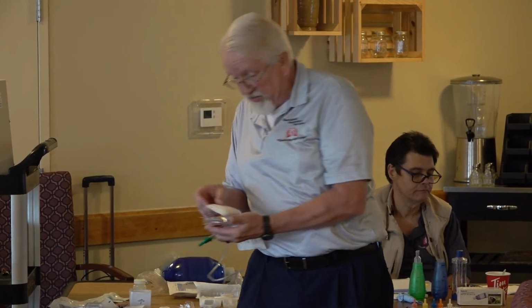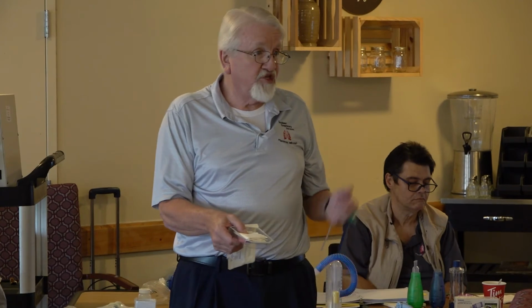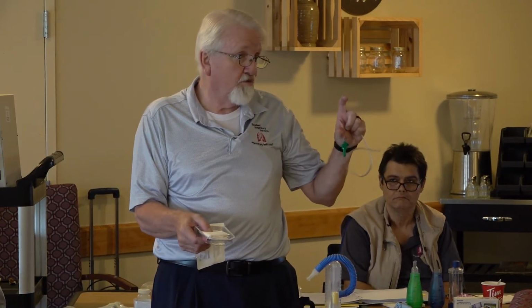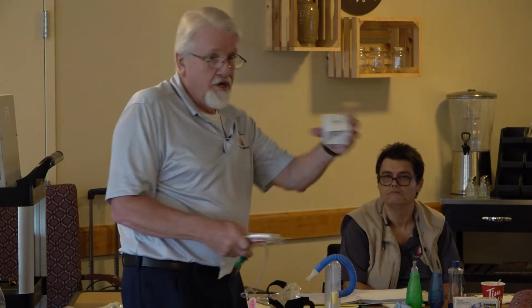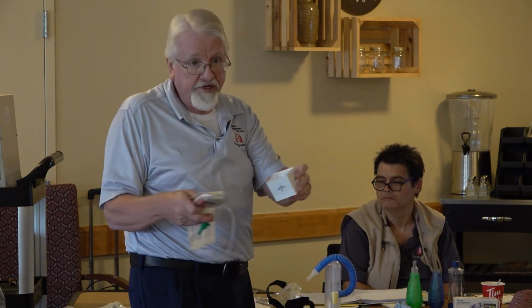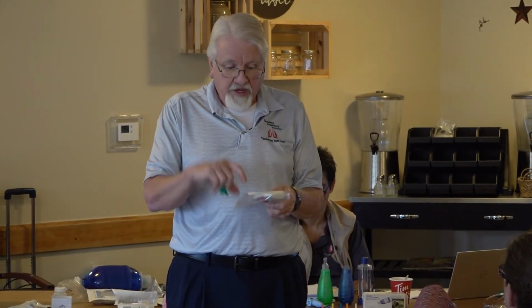When you first open your pack, this particular pack only has sterile gloves and a catheter. So you're going to need a container of sterile water, probably a little box to put some water in.